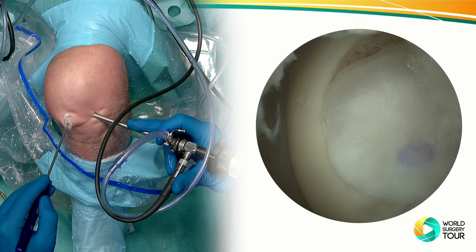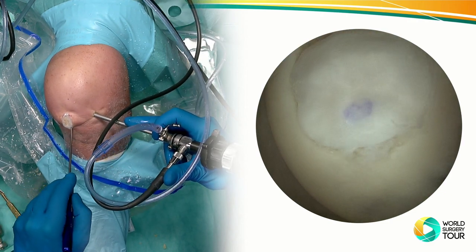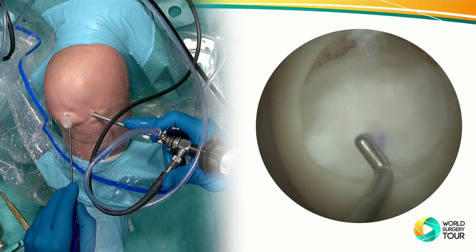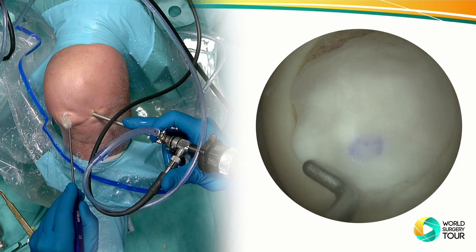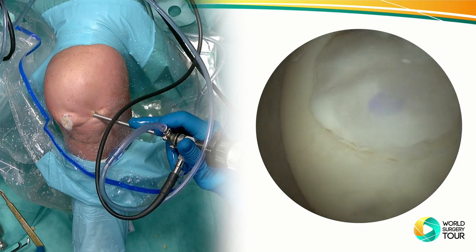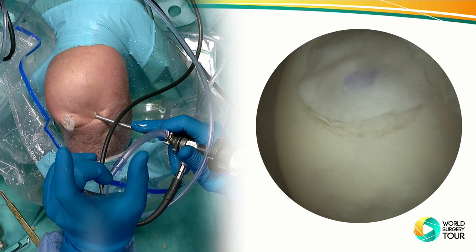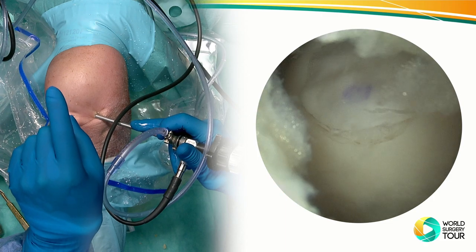Sometimes it's also nice to have a little larger instrument which can really compress, push down a little bit. Exactly. See, can push it down. And then eventually just let it rest and let it heal. Okay. As you can see, this already covers about 50% of the diameter of the femoral condyle. If you have a larger defect, you can obviously now expand it to the lower part.